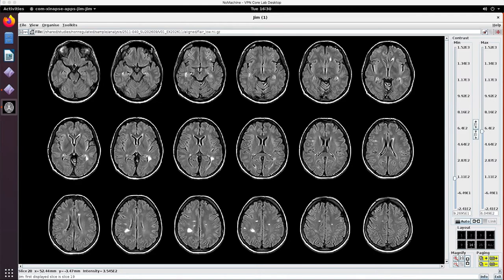So I want to point out that we don't have time in this brief tutorial series to really go into all the intricacies of the pathology, what these lesions represent, all the details of every false positive, false negative, types, diversity. And so you should certainly take some time to look at some of the additional resources, in particular the Atlas of Lesions in MS that is part of SOP D1000 at the BNAC. It is an incredibly valuable resource, and you should certainly take some time to look through it.